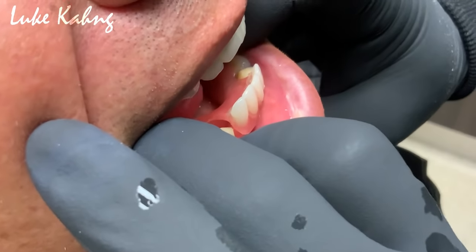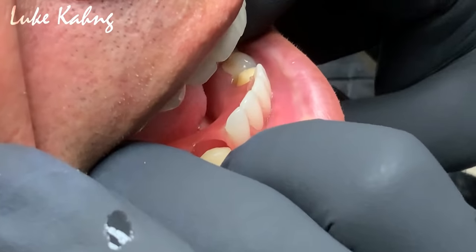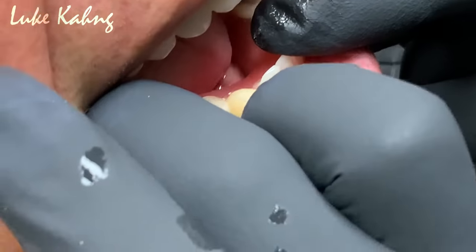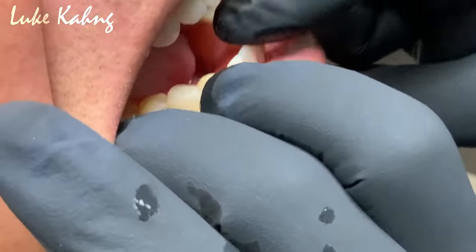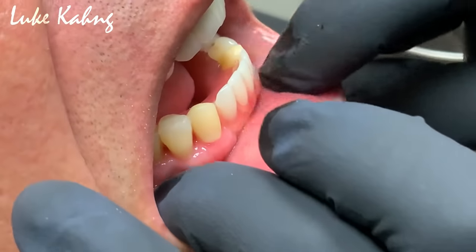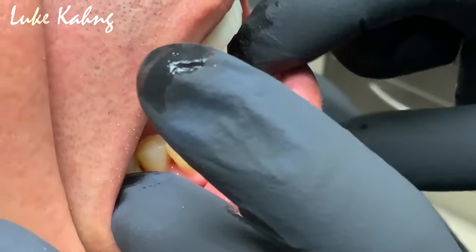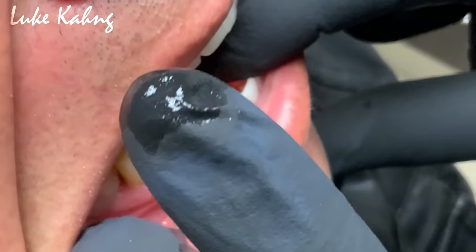And we'll just put it in gently, okay? And of course, this is a TCS unbreakable fiberflex partial that we made here in the lab thanks to material offered by our friends at TCS Dental. Okay. It's a little tight.